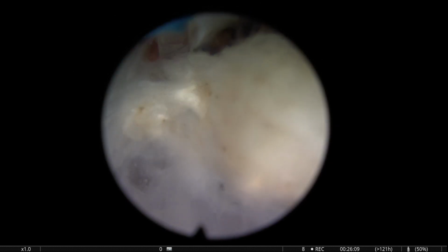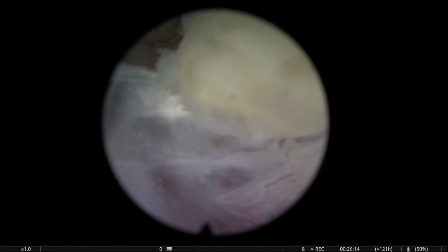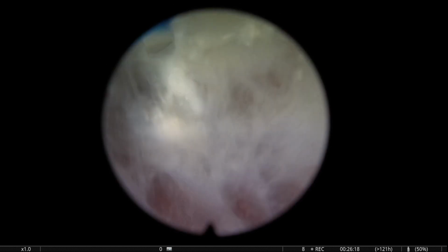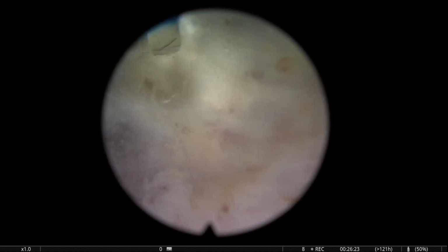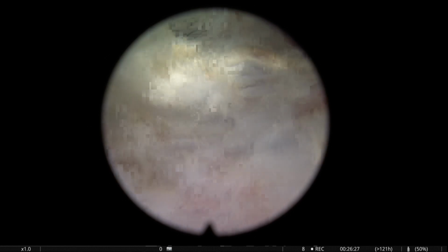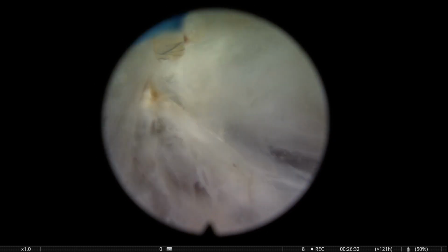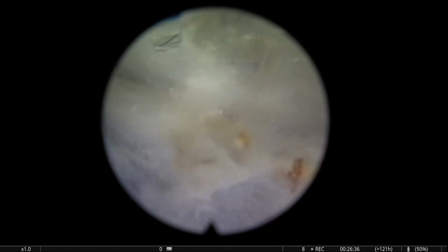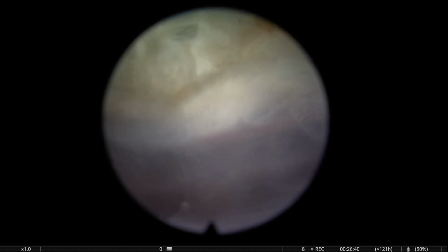So you see, for the coagulation of the vessel that I just did, I was using the same pedal, but I just increased the distance to get a coagulation effect. And here you see that the fiber is aiming constantly towards the upper part, towards the adenoma, so that the energy is not coming into the capsule. It's more on the upper page of the book, if you know what I mean. Here we are seeing that the capsule gets very, very thin.